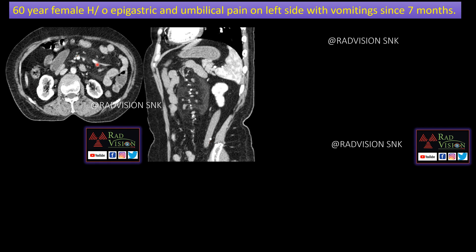Next case: a 60-year-old female with epigastric and umbilical pain on the left side and vomiting since 7 months. You can see there is an increased area of fat attenuation noted around the mesenteric vessels, and this increased fat attenuation displaces the bowel loops. The mesenteric vessels are seen at the center of the lesion, and there is a capsule-like structure separating the fat density from the bowel loops. This is a classical case of mesenteric panniculitis.